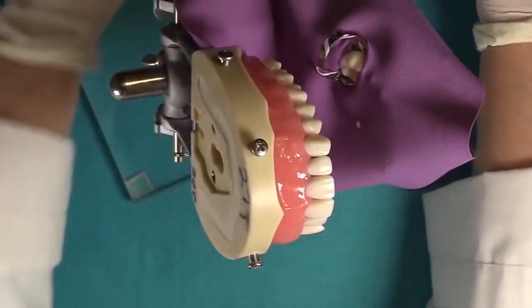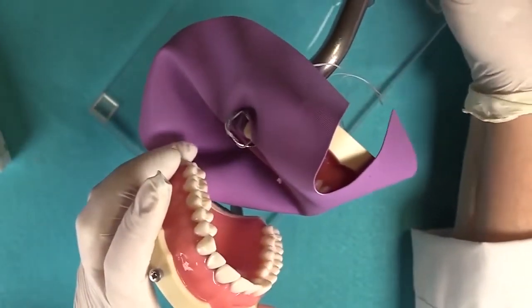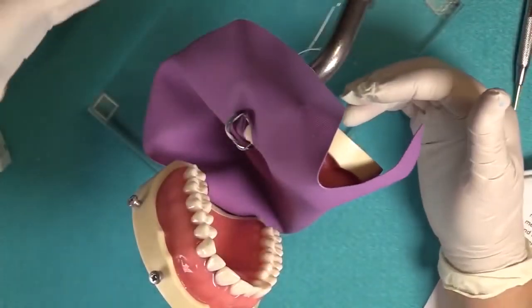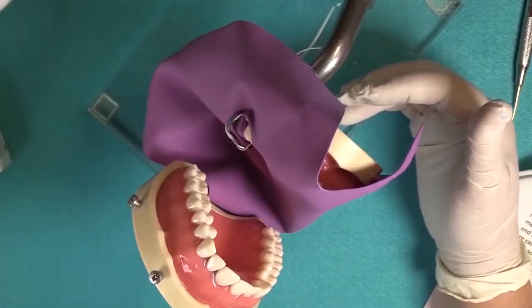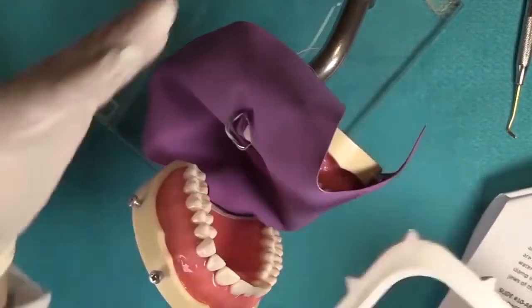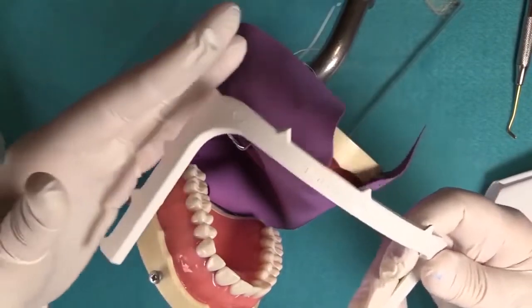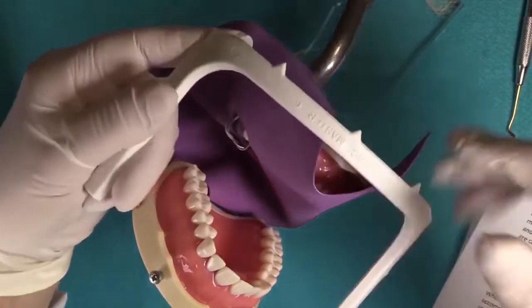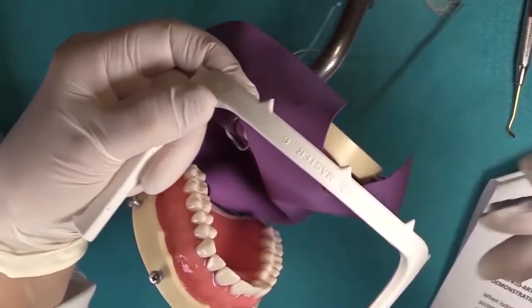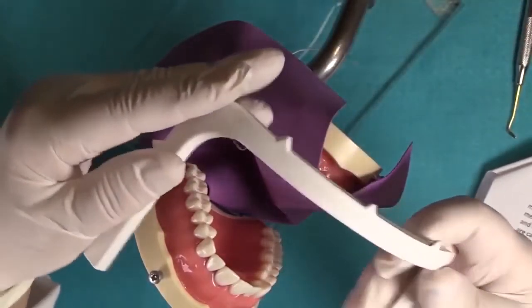Now let me show you how I do this, and I'm showing you how I do this when I'm working by myself. Obviously, if you have an auxiliary to assist you, your auxiliary would hook one side of the frame and the operator the other, but I'm showing you how I do this by myself. So I come in parallel, I'm at the 11 o'clock operating position. I come in parallel to the patient's face. Notice the bottom of the U is by the chin, and the curve is facing outward, following the curvature of the chin.